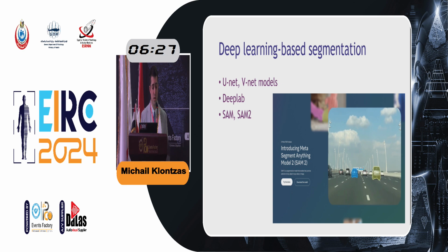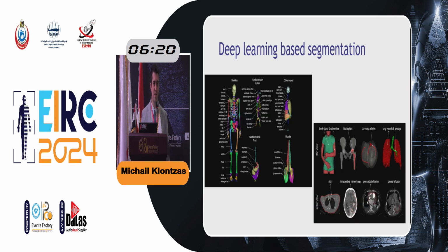These are some of the models that you can find out there, and these have been used to do large-scale segmentation within the body, and of course with any type of tissue that you can imagine. And this is the TotalSegmentator model that has been incorporated in several types of open access software, for example 3D Slicer. And with the TotalSegmentator, you can extract segments from CT and from MR. MR is being released soon. A new version of it is being released soon.